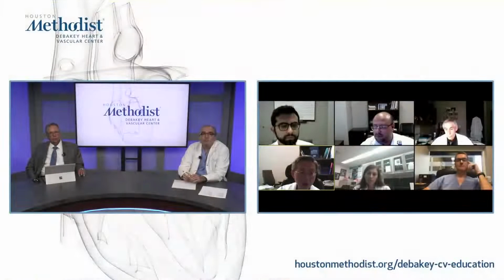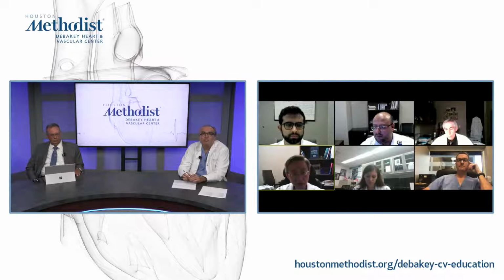So we want to acquire retrospective gating, no dose modulation. We want to see all the details, as much detail as possible. The slower the heart rate, the more important, because it allows us to see the detail. Too fast a heart rate, more motion. And the key here is you need to deliver enough contrast around the valve to have a good study. So essentially, yes, we need probably a top of the line camera with good temporal resolution and good spatial resolution, and using retrospective gated scan mode.